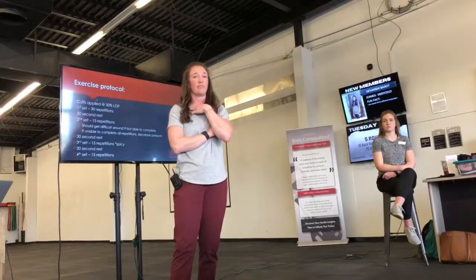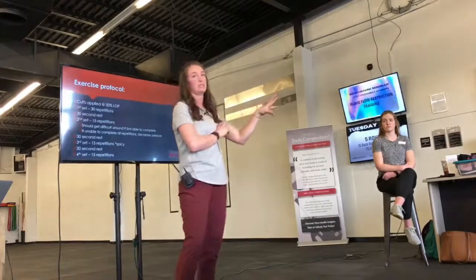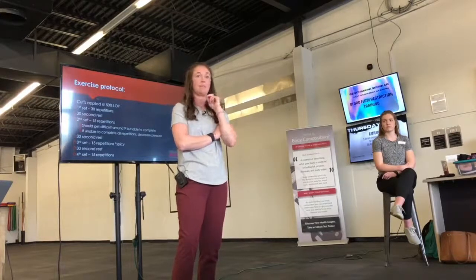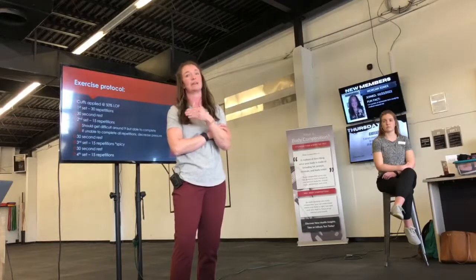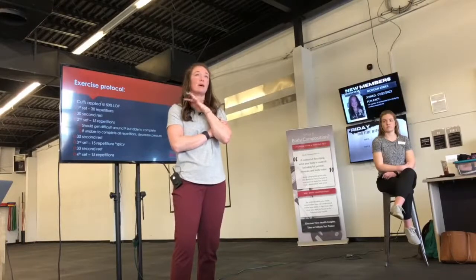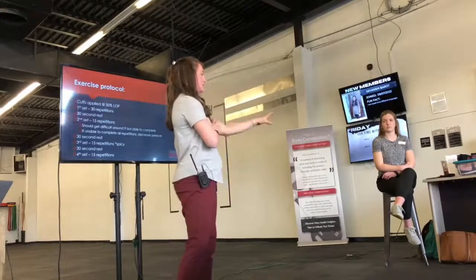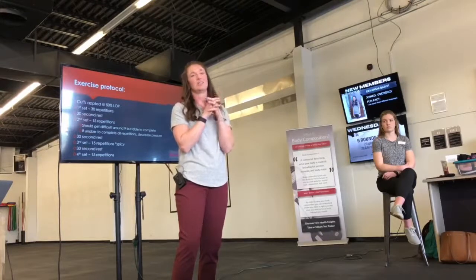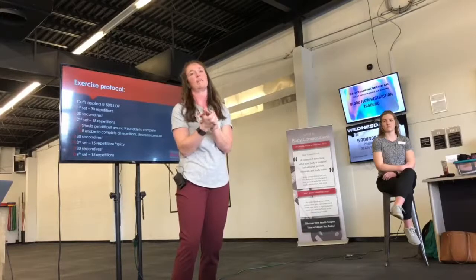I don't know enough about the flossing really to tell you, because again, we're determining this via a protocol how much occlusion is applied. I pump it up to 100% and then I back off until I can start feeling the arterial blood flow again. So we're not exercising at full 100% occlusion, and this equipment allows me to figure that out. So I don't really know how using just tubing allows you to do that. I just don't know enough about that style.